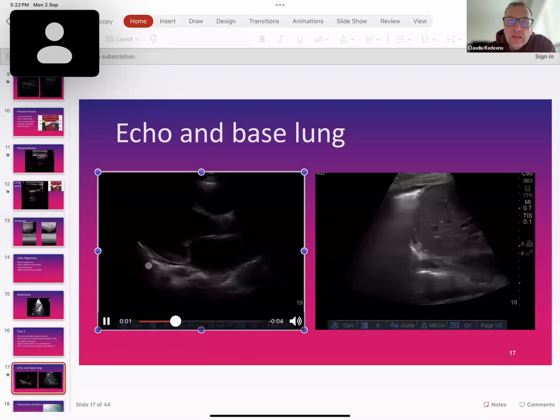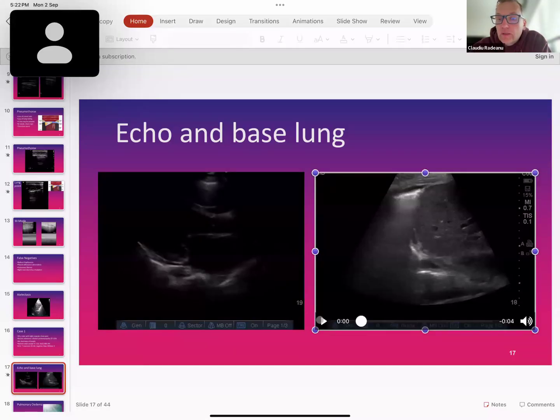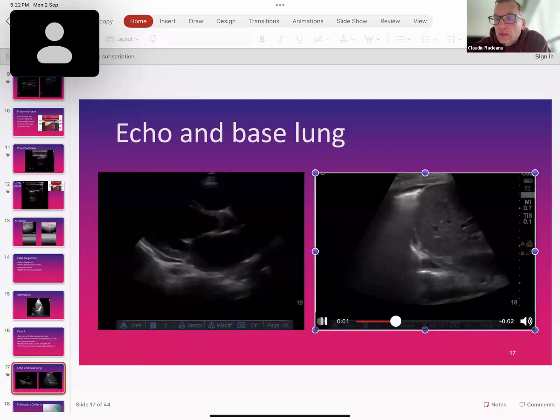All right, so this is his heart, in a parasternal long axis. You have a very big heart with very poor contractility, so it has quite severe dilated cardiomyopathy. Bear in mind, we're talking about a 30-year-old guy who has a dilated left ventricle, a dilated left atrium, and the heart is contracting very poorly. It's very weak.